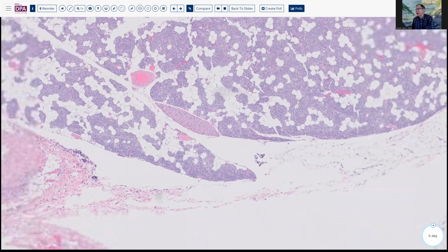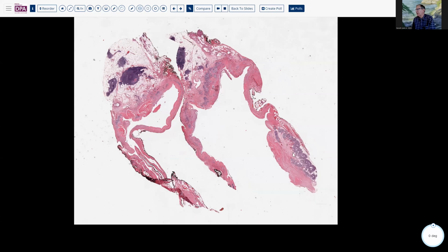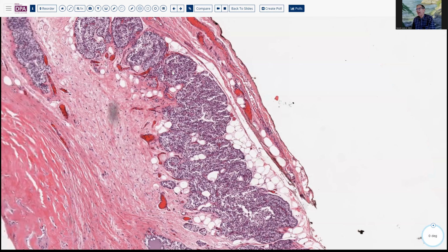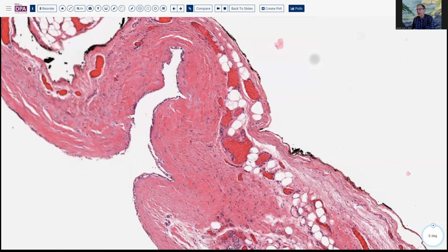Now, in addition to neoplastic disease and hyperplastic disease, there's one important disorder which can be encountered, which we present here, which, as you can see, is a cystic space. In the wall of this cyst is fairly normal appearing parathyroid tissue, a little bit of admixed fat associated with it, some clear cells. But then we have this fibrous walled cyst, which also is lined by the characteristic cellular components of the parathyroid.